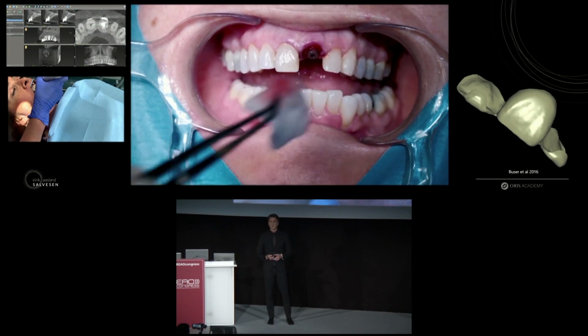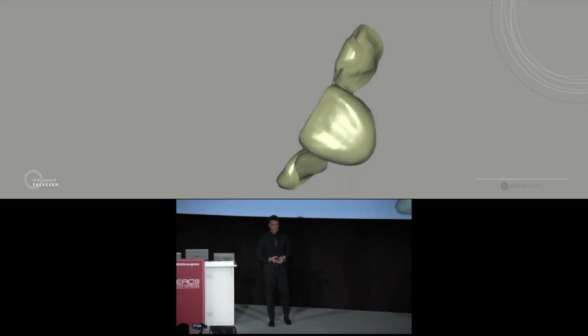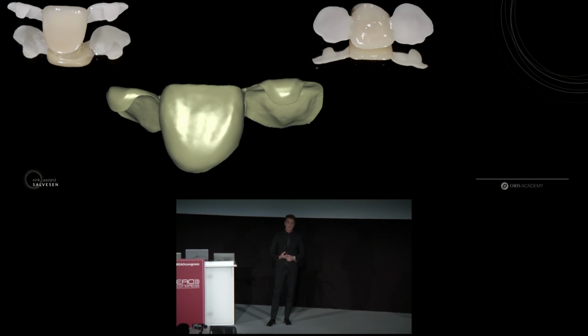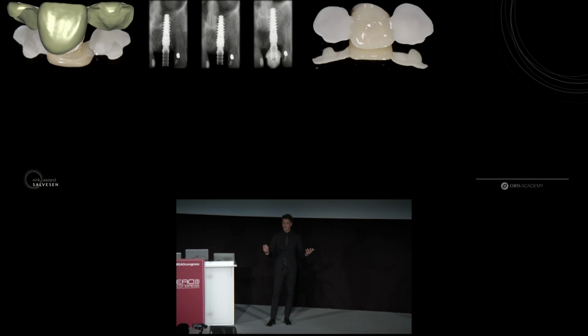So that's the case when it's done surgically, and then we move the patient, or my colleague now, into another office. And then we will start working on the temporary. The temp shell will be produced pre-op by the lab, looking like this in acrylic or PMMA or whatever material you would like. It's just important that it has some opacity. It needs to be not that translucent, because then it will be grayish. And then we transform these.